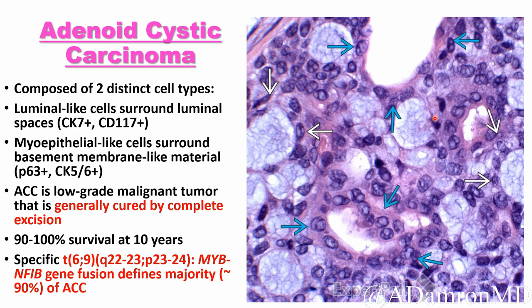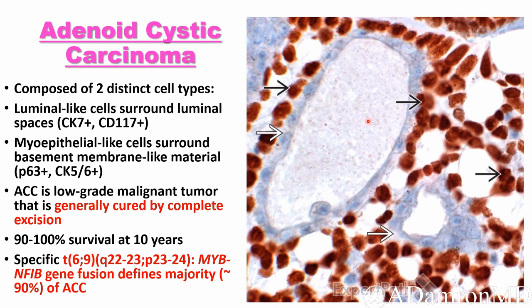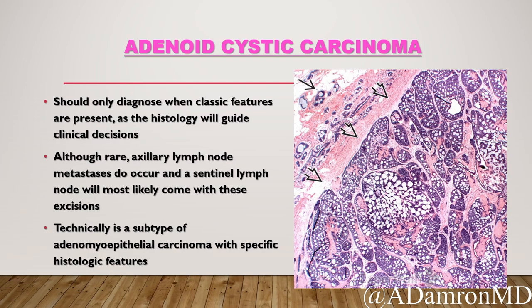Ninety percent of adenoid cystic carcinomas are associated with a very distinct translocation: the MYB-NFIB gene fusion at t(6;9). Keep in mind ten percent may not have that gene fusion, and more importantly, in higher-grade lesions that fusion may not be there - making the distinction between high-grade adenoid cystic and adenomyoepithelial carcinoma that much more difficult when CD117 isn't helping either. The CD117 staining highlights the luminal-like cells, and p63 highlights the myoepithelial-like cells, demonstrating that dual cell population in these tumors.